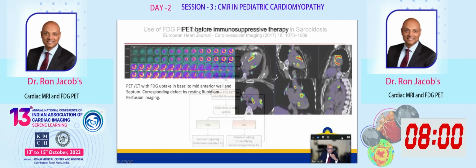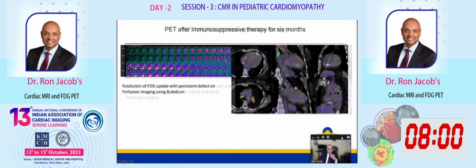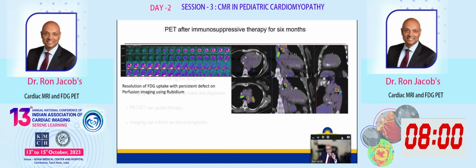This is a patient with extensive uptake in the base corresponding to LGE, with perhaps a perfusion defect, and this is what it looks like after immunosuppressive therapy. There's a persistent perfusion defect, which you will often see in burnt out sarcoids, where you have a persistent perfusion defect, but the inflammatory component is gone.